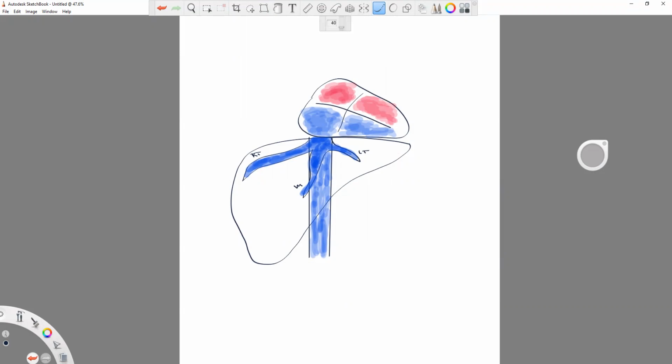Let's see. Here is our point of view, from down here. We have a curved transducer in the epigastrium, right? And that curved transducer gives us a view like that on our screen. So whatever is inside of this cut off bundt cake of a triangle is what we're going to see on our screen, right? Well, I'll draw the screen in after this.